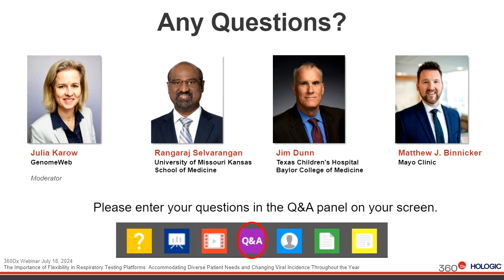Yeah, we do post our recommended testing algorithm on our lab test catalog. Our physicians have access to that. We do also provide some education to our physicians on the testing that we offer, which panels we're offering can change season to season, and when they might want to order those different panels dependent on their patient's clinical presentation. Many of our outpatients who are calling in will get a hold of a nurse who will triage the case, and that testing stewardship team that I mentioned, ID, primary care, clinical microbiology, will come up with a pretty extensive question and answer list for the nurses to walk through with the patients that helps to ultimately guide them towards which panel of tests to order.